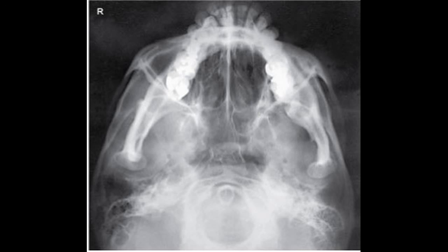The mandibular condyles are anterior to the petrous pyramids, and the brightness and contrast looks good. I think I'd be able to assess air fluid levels if there were any present. So this image is also acceptable, and that wraps up my exam.